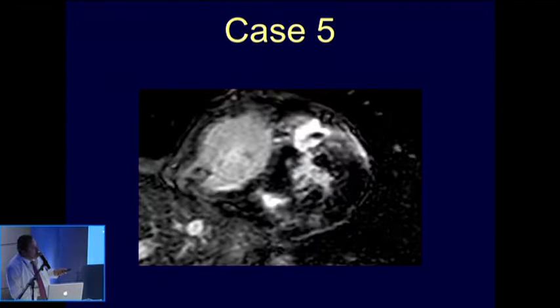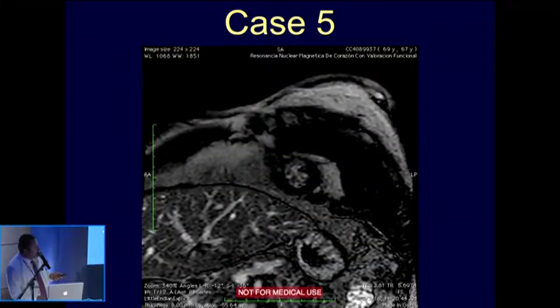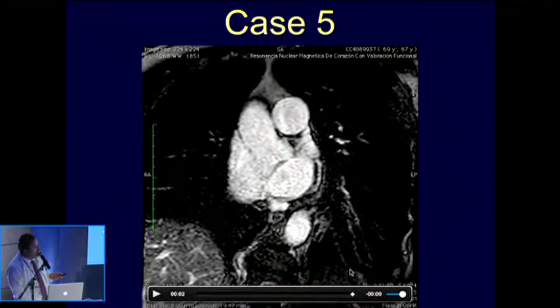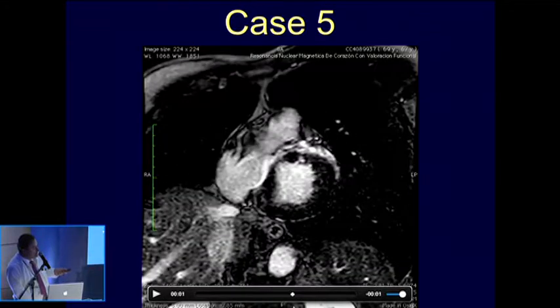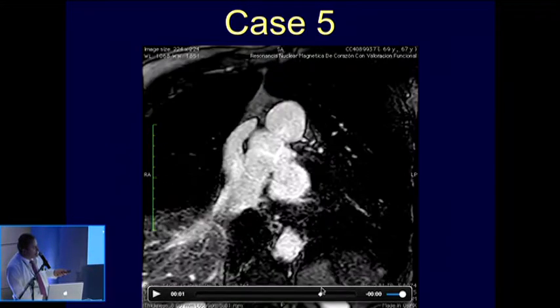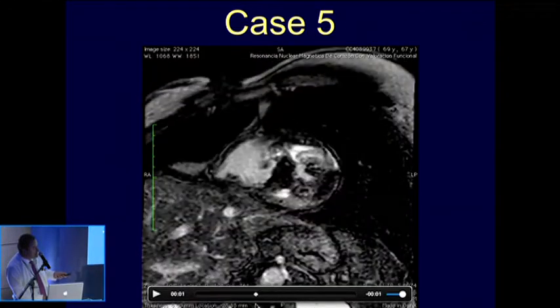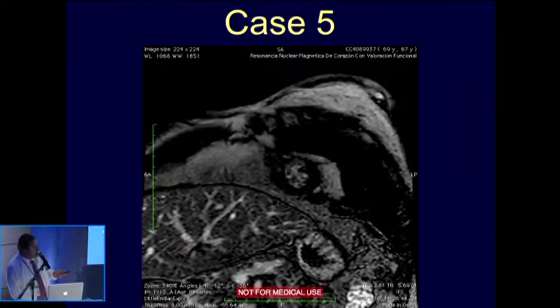They glitter. The glitter is exaggerated here at 10 a.m. and at 7 a.m. and 10 a.m. These areas are particularly shiny, and this is one of the typical characteristics of hypertrophic cardiomyopathy when we place these patients under the magnet. This is the heart axis, and we see that from the very beginning there is enhancement. We continue moving forward towards the heart, and definitely there is more enhancement in these areas, which are the critical areas in this type of cardiomyopathies.